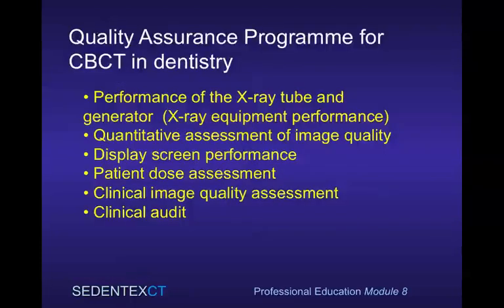So in conclusion, we've identified 6 components of the quality assurance program for cone beam CT in dentistry: the performance of the X-ray tube and generator, quantitative assessment of image quality, display screen performance, patient dose assessment, clinical image quality assessment, and clinical audit.